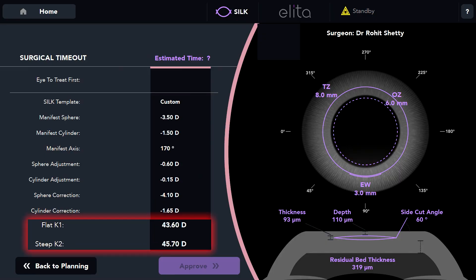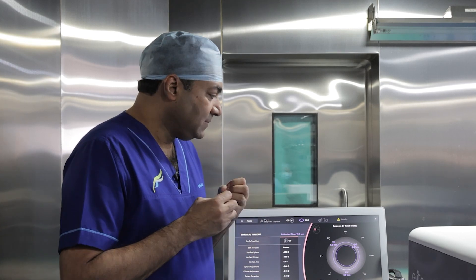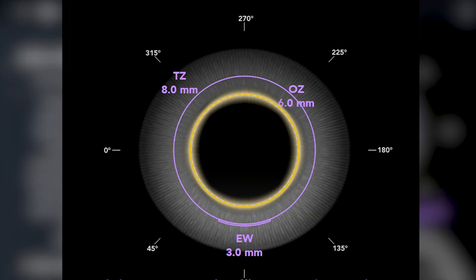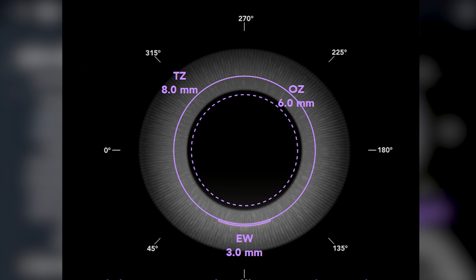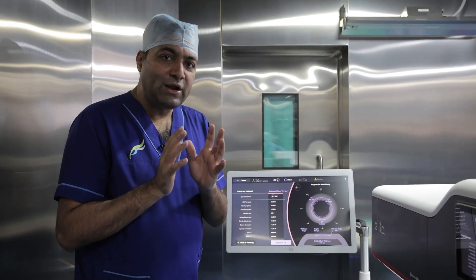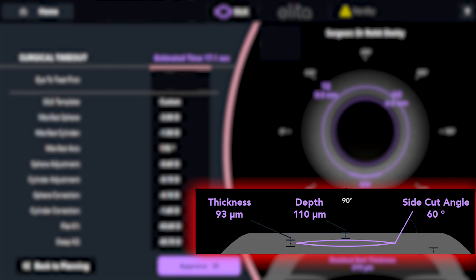There are good readings here. This interface is something I really enjoy — it has the finesse of a beautiful refractive procedure. The refractive lenticule has a zone of six millimeters, a transition zone of eight, and an incision of around three millimeters. It gives you all the other data — the data of depth, the side cut angle. What I want you to focus on here is the shape of the lenticule. The shape of this lenticule is biconvex, which is very important to understand when you are actually dissecting it, which I'm going to demonstrate as we move on.